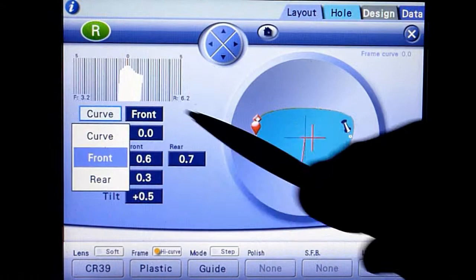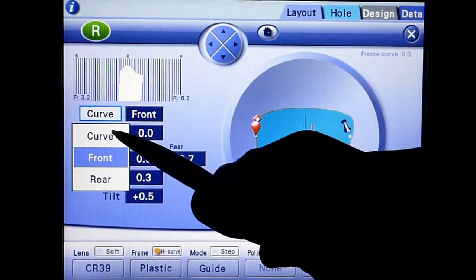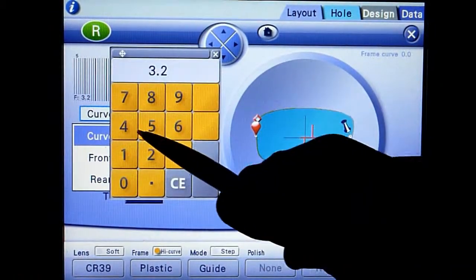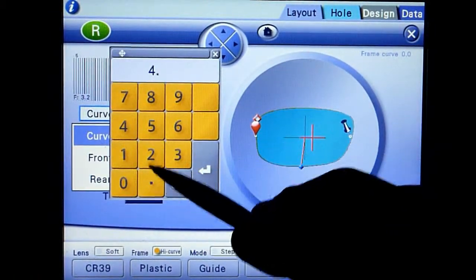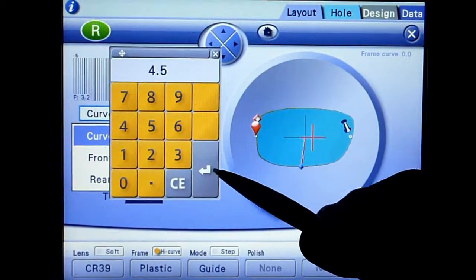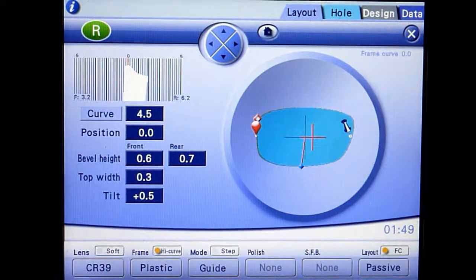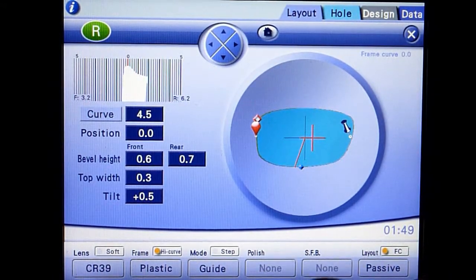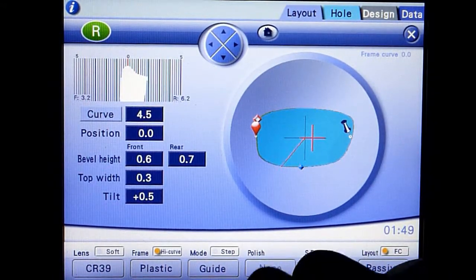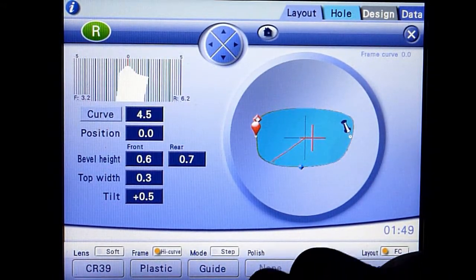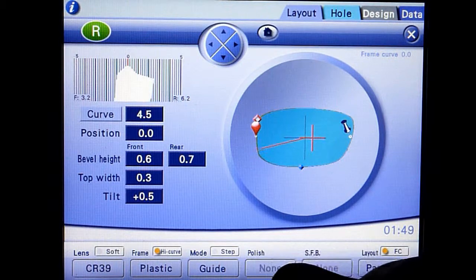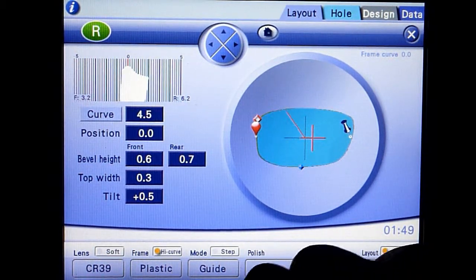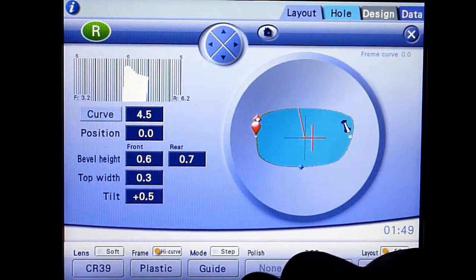Touch the curve button and then select curve again. Enter the bevel curve value to best match the frame curve. Review the bevel placement using the jog dial again.